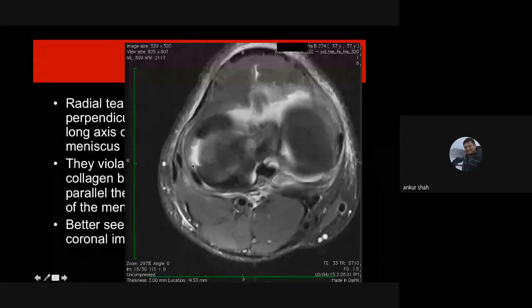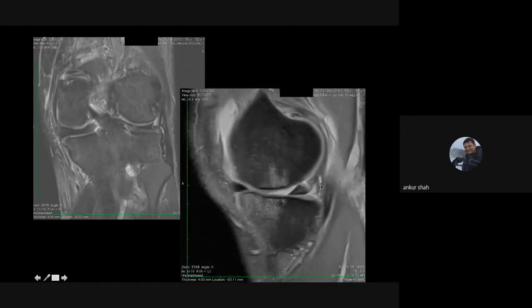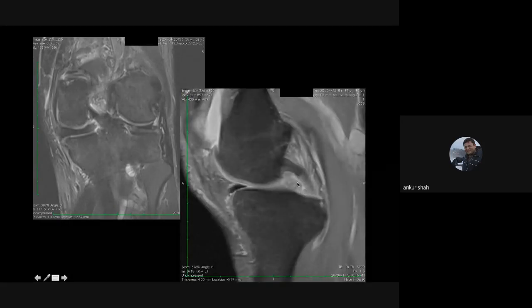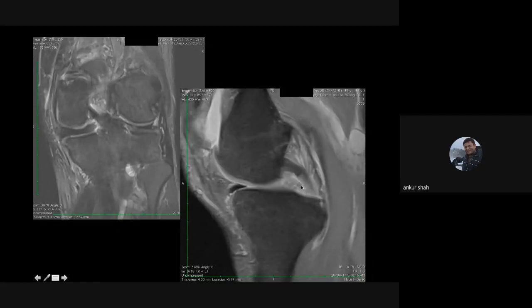With a radial tear, there is no missing meniscal fragment — both torn ends are displaced. There is another tear that looks like a radial tear in orientation but is more common in the degenerative knee joint. It almost always occurs adjacent to the posterior horn of the medial meniscus. The sign classically described for this is the ghost meniscus sign — you see the posterior horn in one image and in the next image it suddenly disappears.